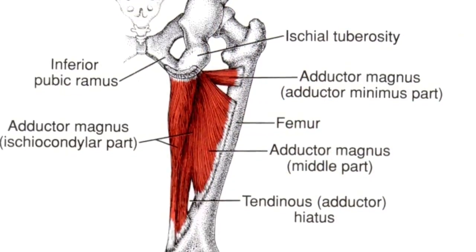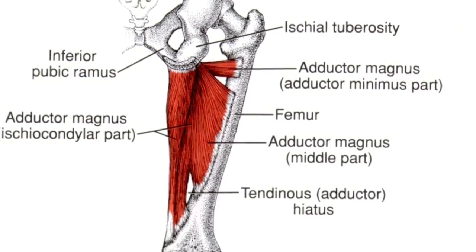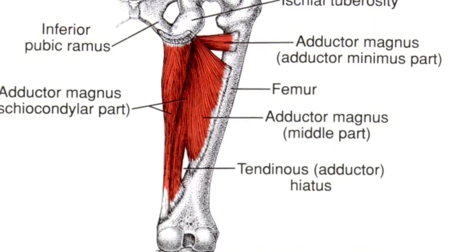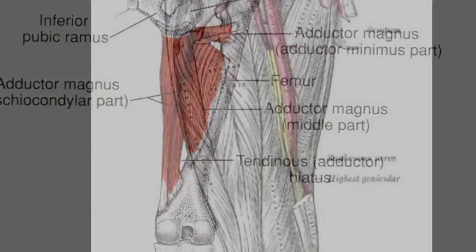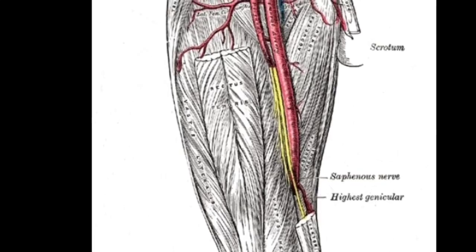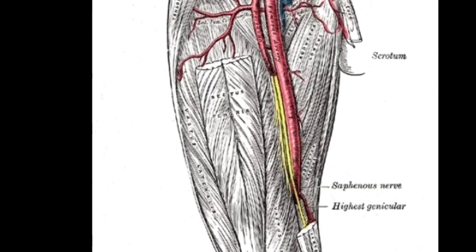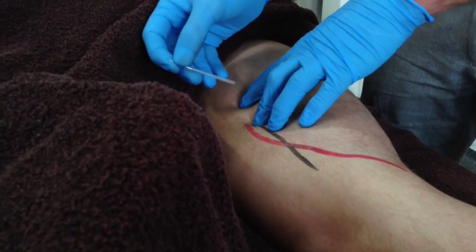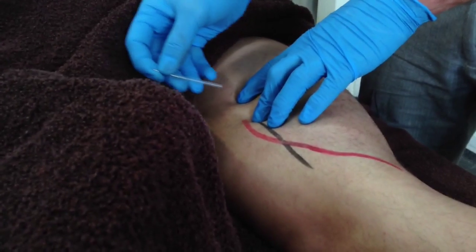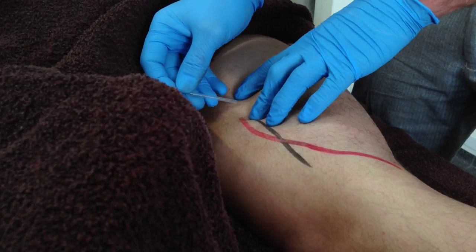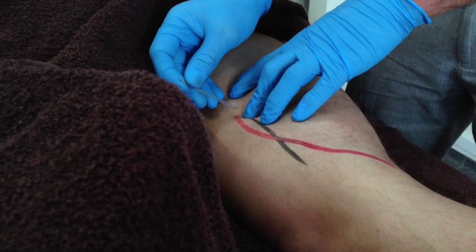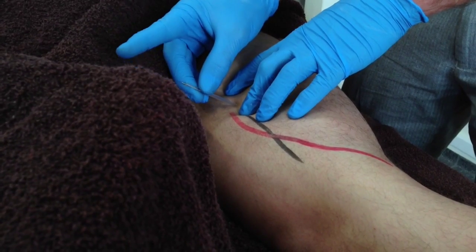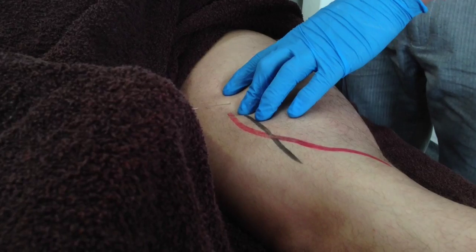The needle is inserted in an anterior to posterior oblique direction, away from the femoral artery and vein, as well as the great saphenous vein and saphenous nerve. The more proximal the application, the lesser the angle that is required to avoid these structures, with the proximal trigger points needled at an almost perpendicular angle to the skin.